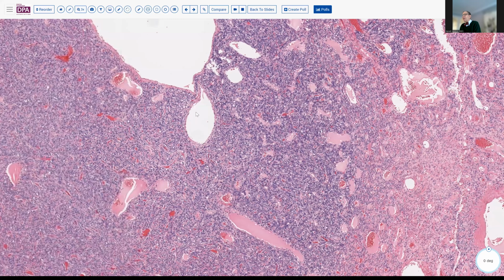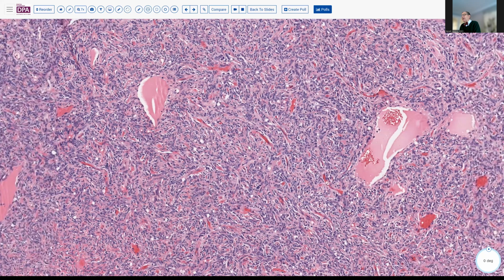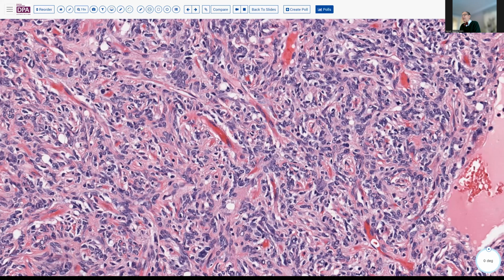I can still recall the very first one of these cases which I encountered as a trainee, which was coming off of the mediastinum and was confused to be either a thymoma or some other sort of lung cancer being involved, but turned out to be this solitary fibrous tumor, which at that time was a so-called fibrous mesothelioma. It had a lot of ropey collagen in it, as well as these cellular kinds of areas.